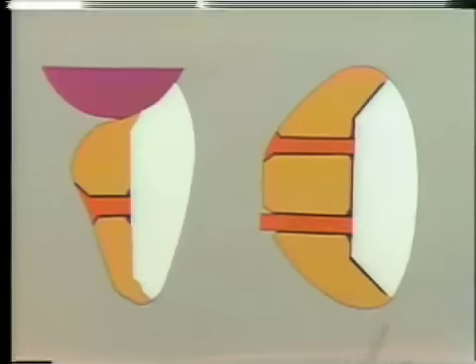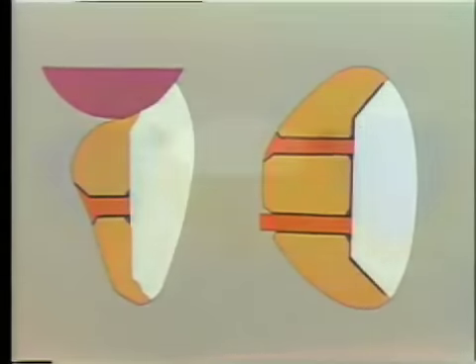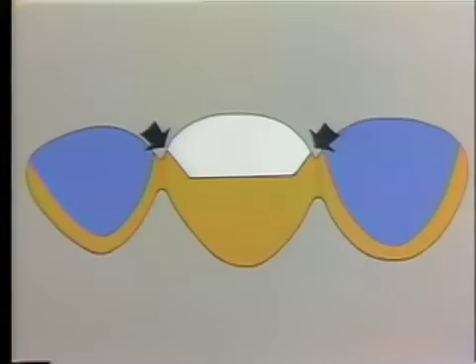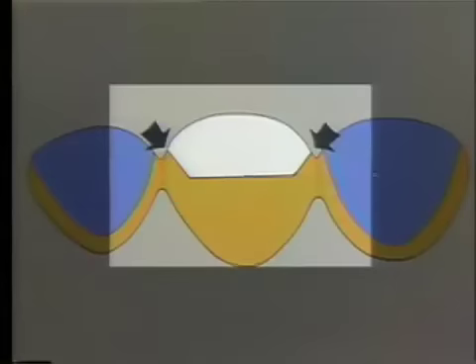The critical nature of this relationship between porcelain and gold here is shown in this other illustration, where the arrow points to that situation. The two blue teeth on either side represent abutment teeth with, say, pin ledge retainers around them seen in cross-section. And you see there the connectors, the soldered joint between the retainer and the Pontic, and how close that comes to the gold into which the porcelain is seated. And you can see that that positioning there is quite critical and has to be worked out on your lab model when these are being constructed.